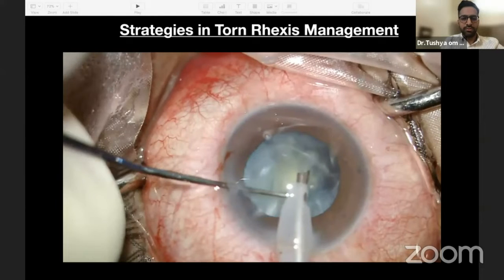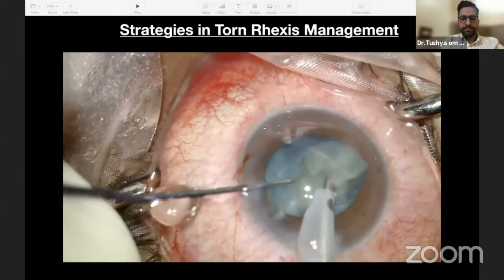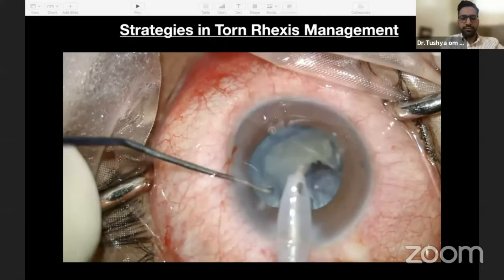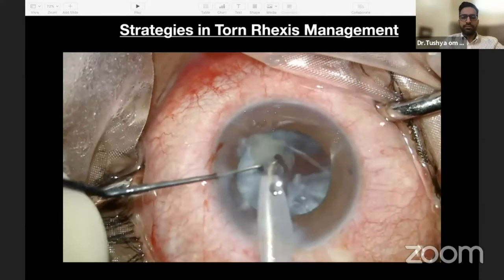The initiation of rotational forces were minimal and were done keeping in mind that the rotational force did not put stress to the extended flap. Last nuclear piece was eaten and nuclear emulsification was completed with the continuous watch on the everted nature of the flap.